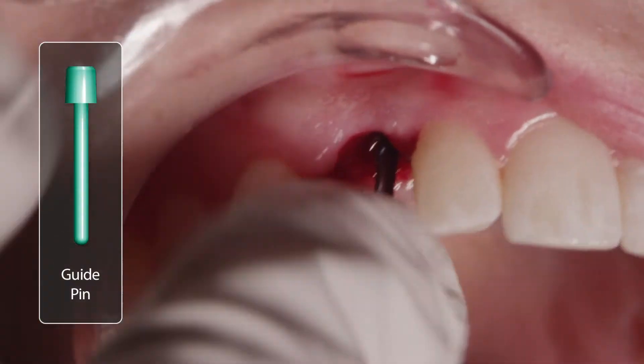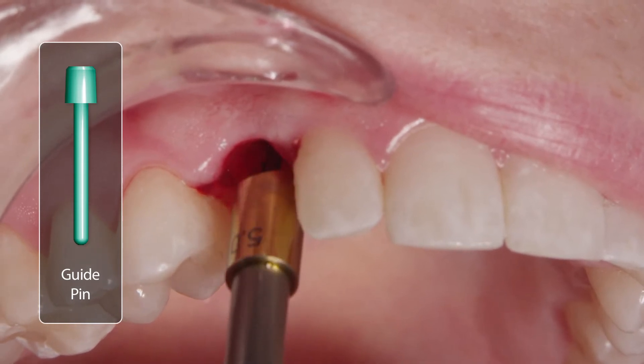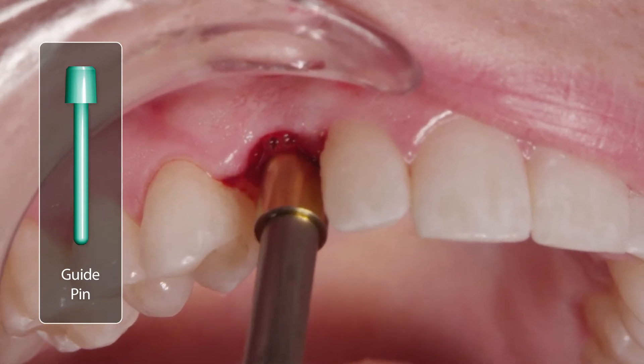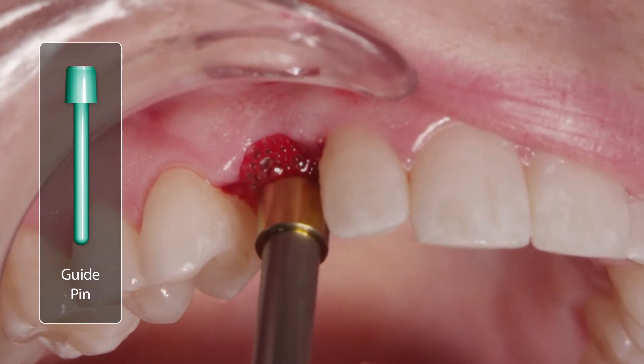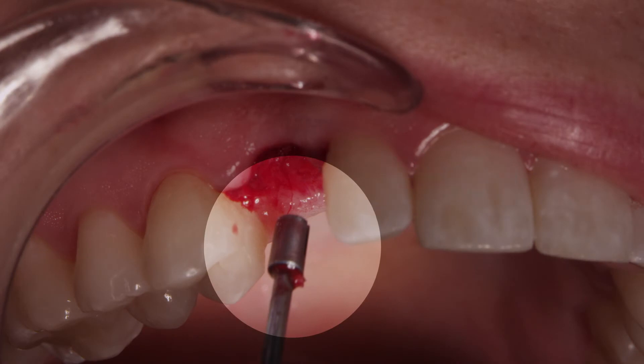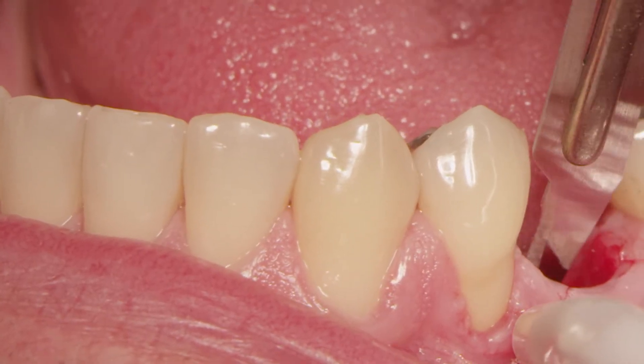You can connect the sulcus formers with the threaded knob or a straight-handle instrument, depending upon the area in the mouth or your personal preference. Both have the same function. Then insert the guide pin into the implant well. Slide the former through the guide pin, pushing hard until it hits the edge of the guide pin, and rotate it clockwise until there is no more resistance from the bone or soft tissue. This is a very safe procedure, since the guide pin protects the implant, preventing any unnecessary or excessive bone elimination. After using the sulcus former, remove the guide pin and reinsert the crown. If you still notice any soft tissue blanching, use a relieving incision in order to cut the tissue fibers.